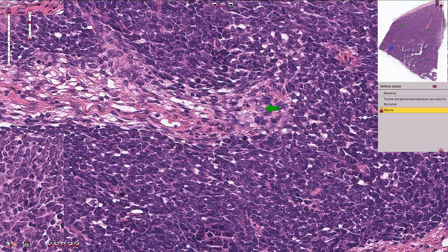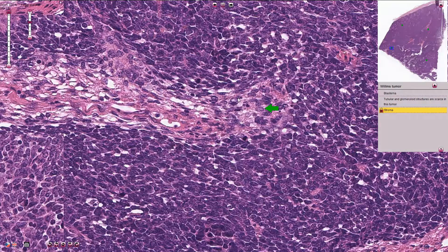The third component is stroma or stromal cells, and those are usually these spindle-shaped cells. It can also include a smooth muscle cell component, or skeletal muscle or fibroblastic differentiation.